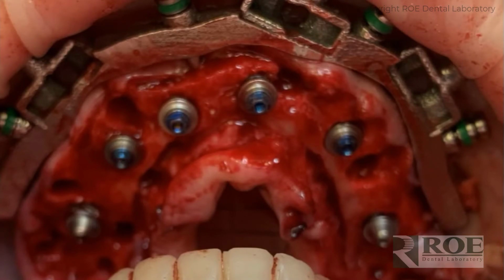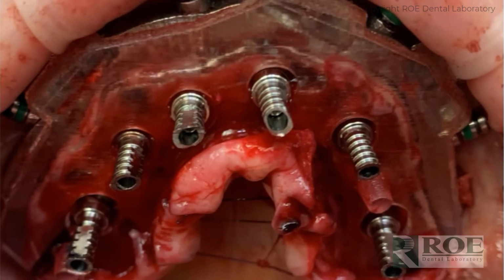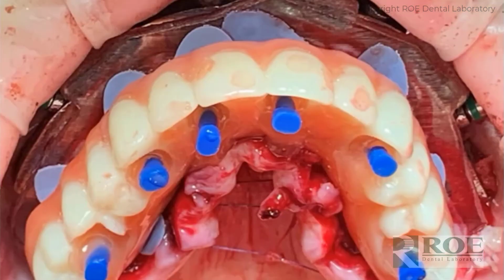And a little fuzzy picture here, but you can see the MUAs are in, and then the temp cylinders go in. And you can see this really did a nice job with orienting the posterior implants. The temp cylinders are straight up and down, which makes picking up the prosthetic quite simple. These blue gaskets come with the case.